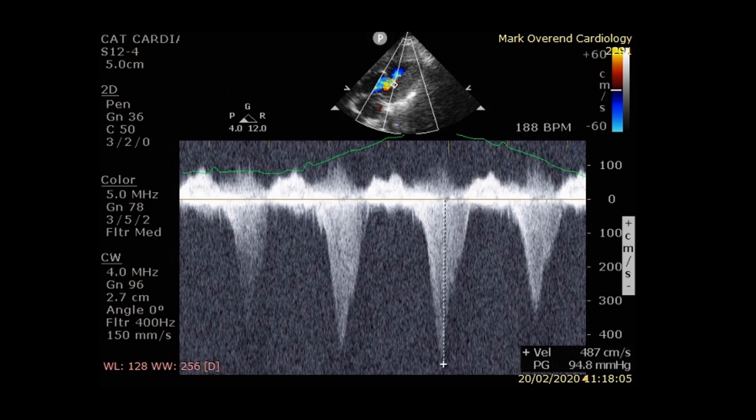With optimal continuous wave Doppler alignment through the obstruction, a peak velocity of 4.8 metres per second was measured, which is equivalent to a pressure gradient of almost 95 millimetres mercury.